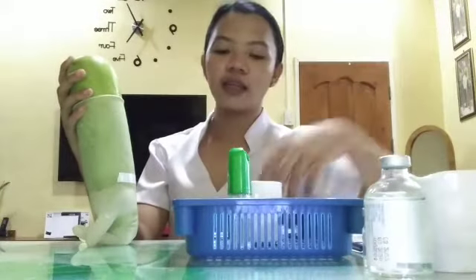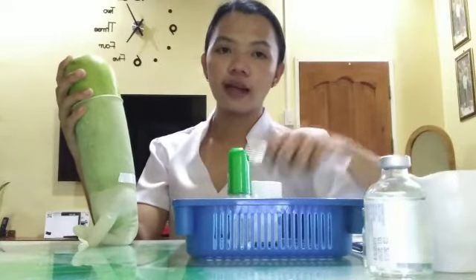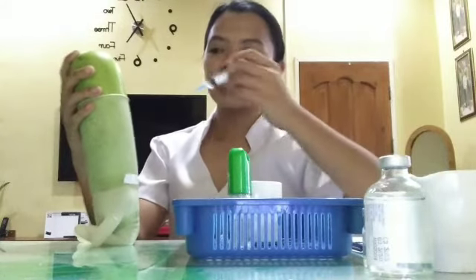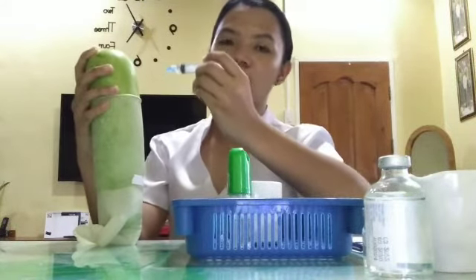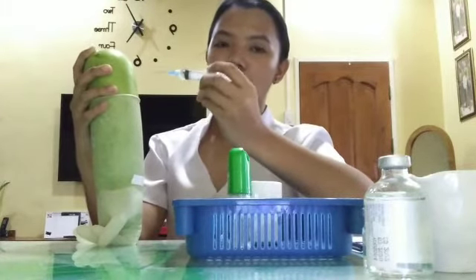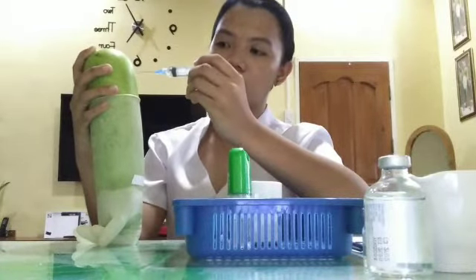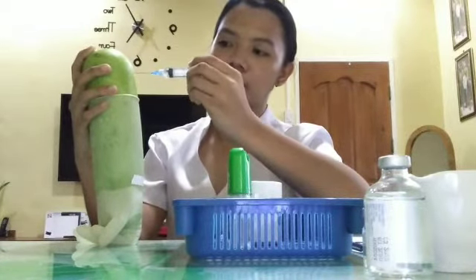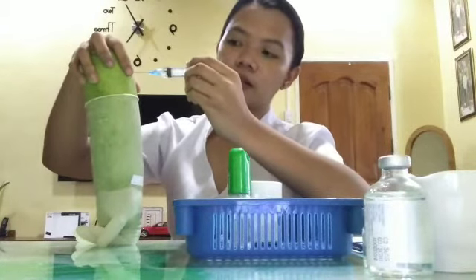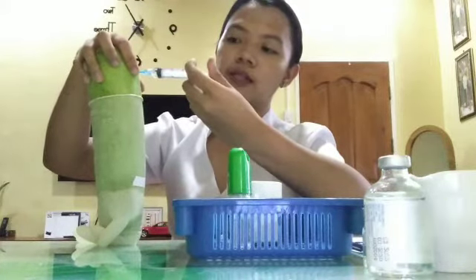And then we will let it dry, and then assuming that it is already dry, we will uncap the needle and position the needle at 90 degrees, because it is the prescribed angle for the intramuscular injection. So here, we will put the needle, we will put our dominant hand here, and then we will release.